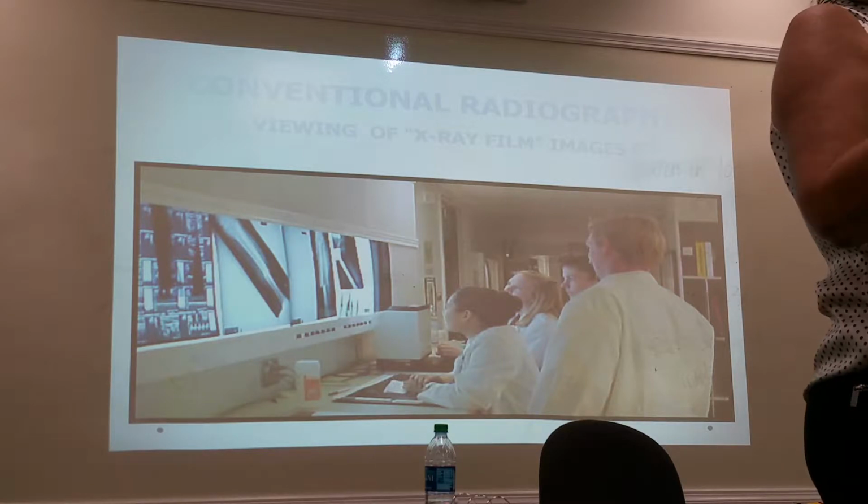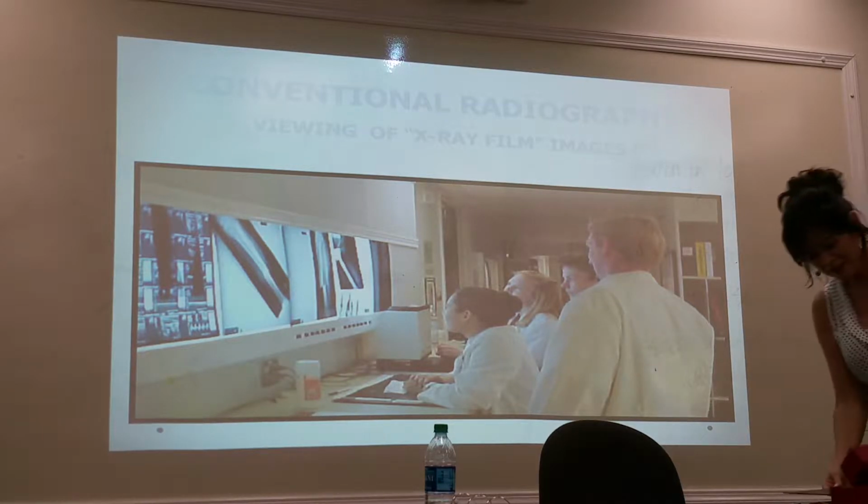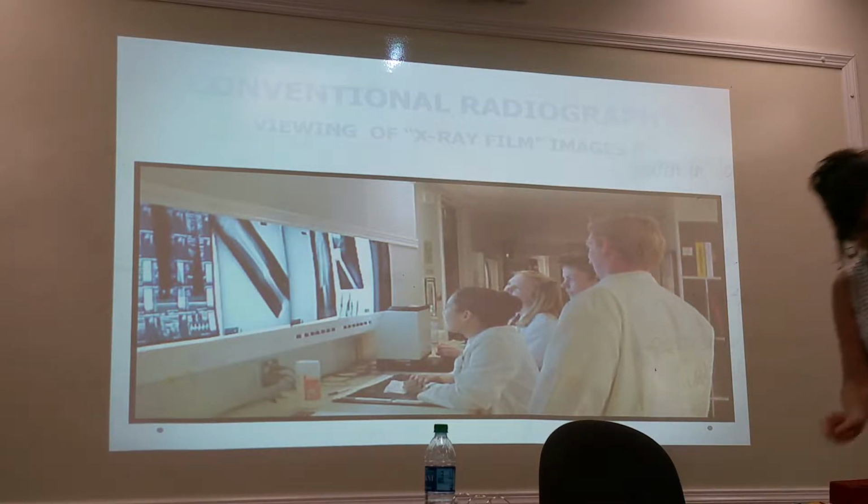It was a high quality piece of glass with the emulsion coated on it. So you don't have a view box to hang it up in. It's too thick for that. So I guess they just held it up to the light. I'm not that old, I don't know. I know I've been in the field for a long time. So that was glass. And then we very quickly evolved to cassettes.